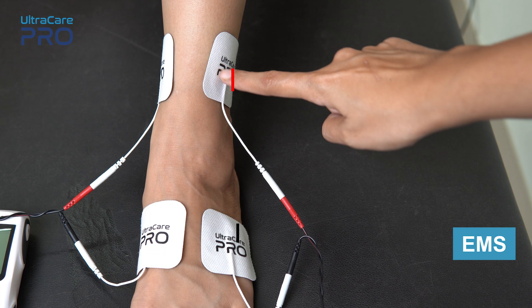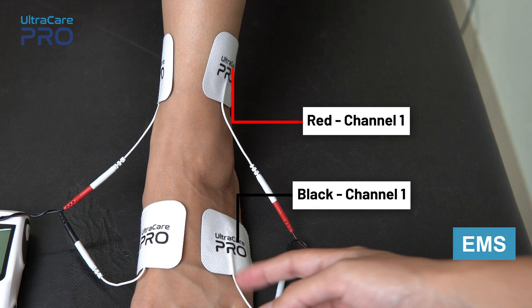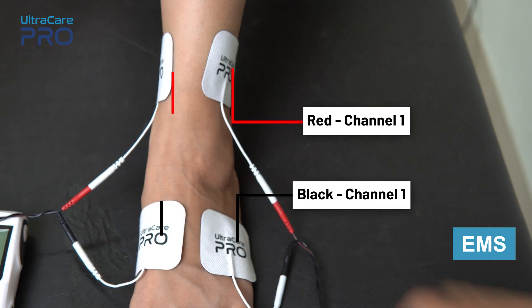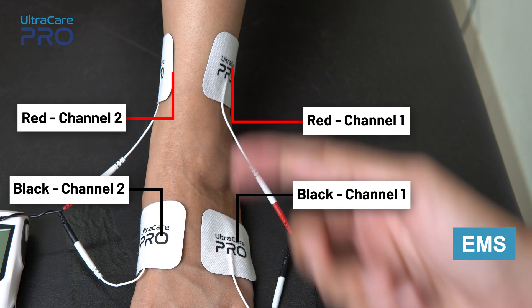For EMS application, place the red and black wire from channel 1 on one side of the ankle. Similarly, place the red and black electrode from channel 2 on the other side of the ankle joint, in a way that the muscles that need to be stimulated are covered.